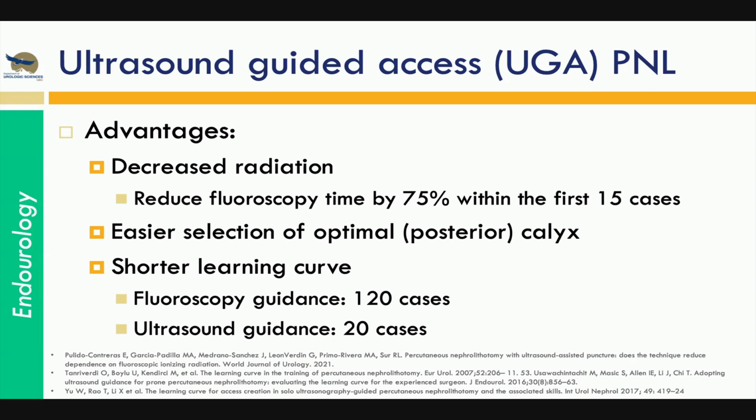And what I thought was interesting was that there were actually 2 different papers that specifically looked at the learning curve of getting into ultrasound-guided access versus fluoroscopy. They estimated in this particular paper that you need over 100 cases to get really comfortable with a fluoroscopic-guided puncture, versus for ultrasound-guided access, people were reasonably obtaining access by about 20 cases.